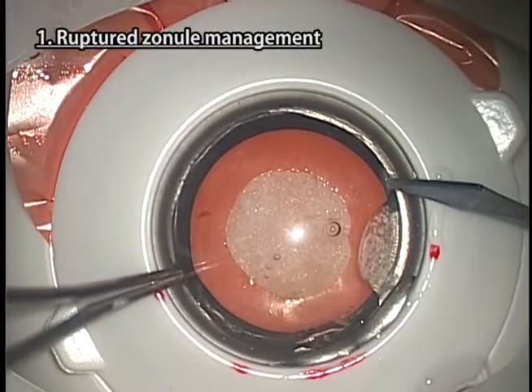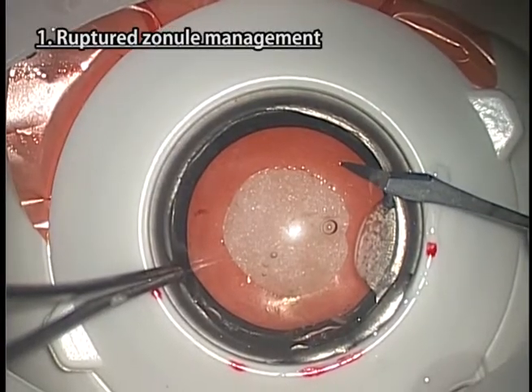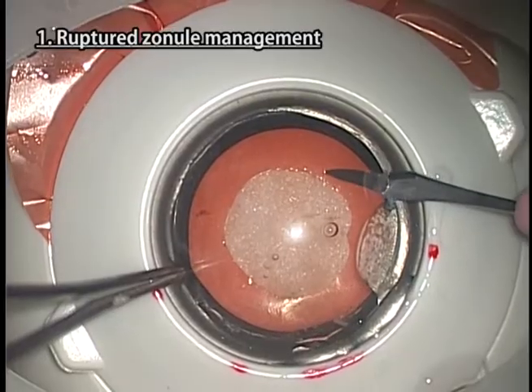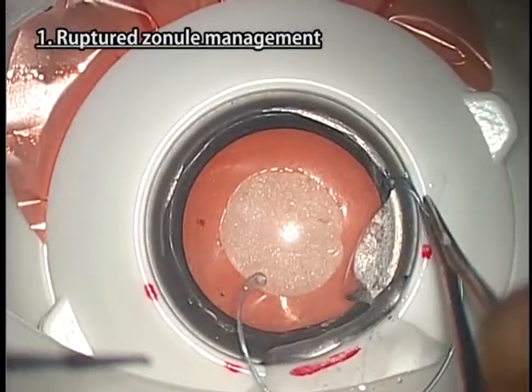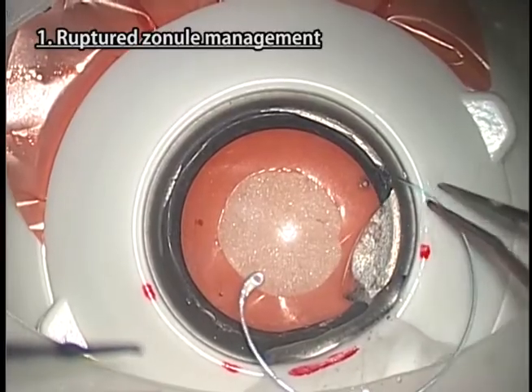Make a slightly larger side port for inserting the CTR, because the cornea of Kitaro is relatively hard and the CTR is a little fragile. Be careful in the position and direction of making the side port.